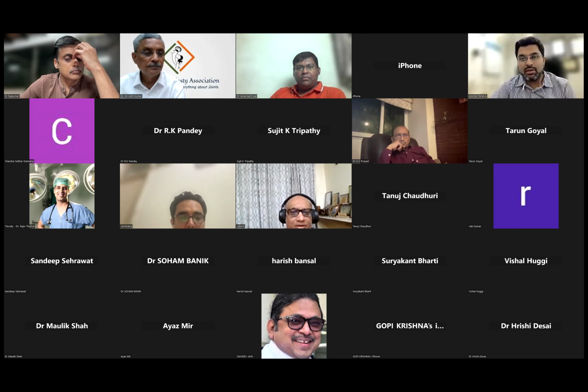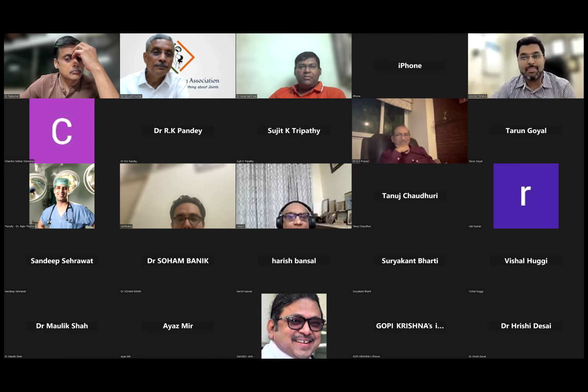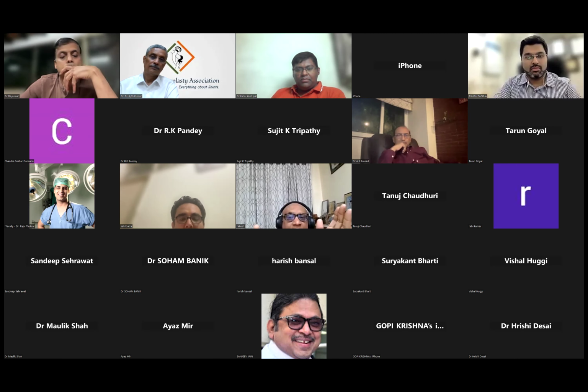Any difference of opinion amongst the faculty? Yeah, Dr. Rajput here. Please, sir, your comment. The trend now is to actually do a combo fixation, preferably a nail and a plate combination. So lateral plate and a nail. The question is, you need to be very sure about your implants that there is a space for putting in the nail. So the older knees which we had, many of them, particularly the smaller sizes, didn't have enough box width. But if you look at all the modern ones, the box is almost disappearing. There is a space for a box, but there is no actually hard box there itself.